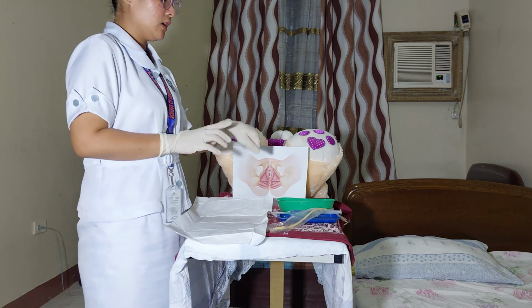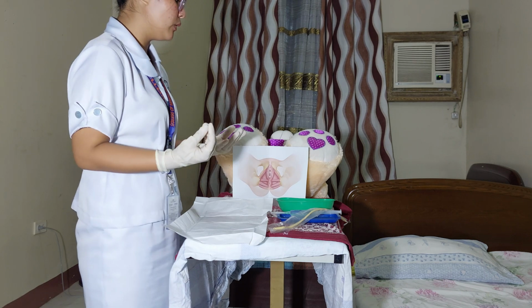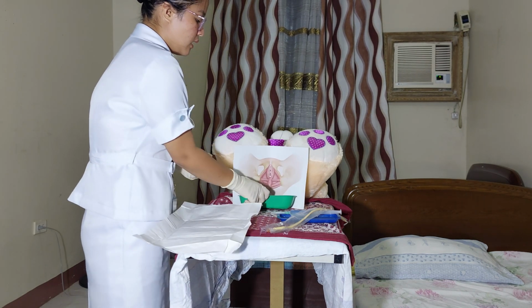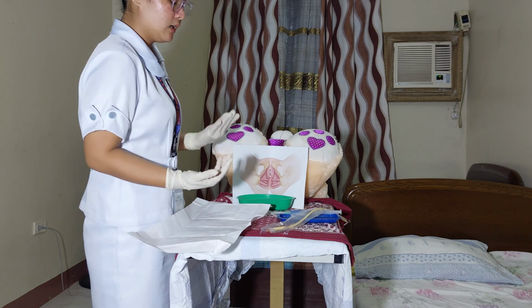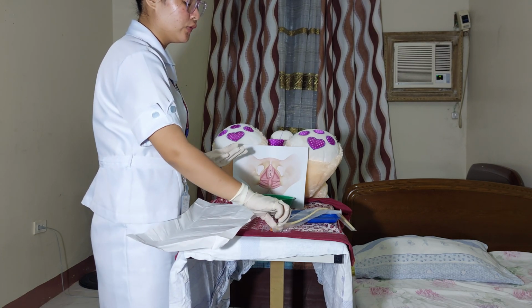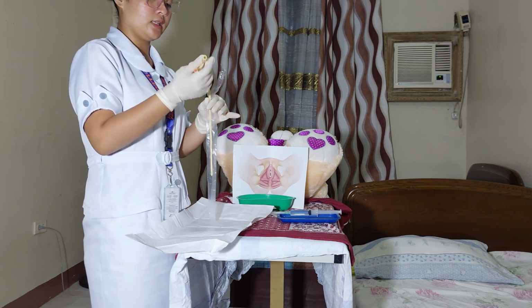going to put some lubricant dito sa aking medicine tray, and I'm going to put the kidney basin dito sa may ilalim ng or dito sa may direkta sa may labasan ng ihi ng patient. So, ngayon po is, ang gagawin ko is i-check ko yung urinary catheter or yung Foley catheter if gumagana ba siya or defect kung hindi siya defected.